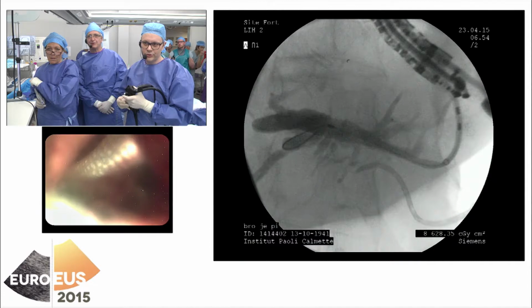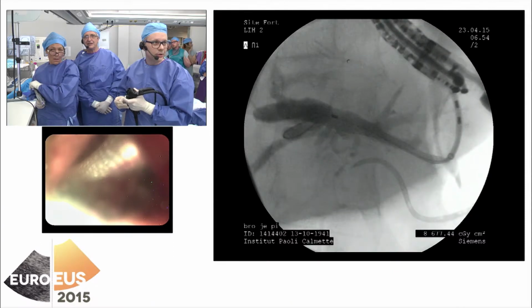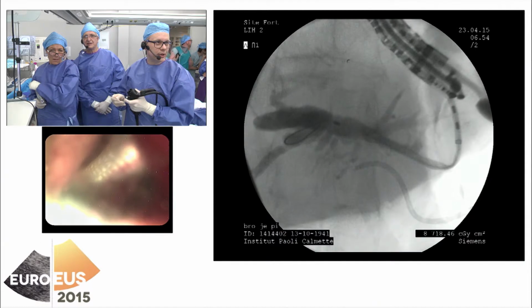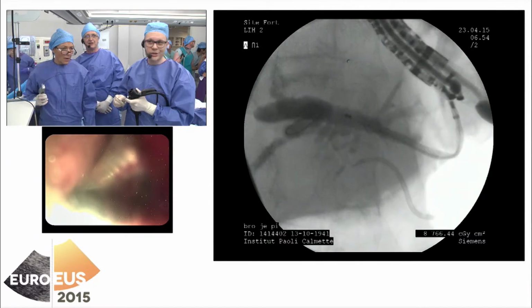Wait. You need to have endoscopic pictures. The position of the scope is less stable. Open, Sonia, vas-y. Yes, open. I pull, and you see the scope very close to the... Tire encore un peu, Erwan. I pull. C'est bien.